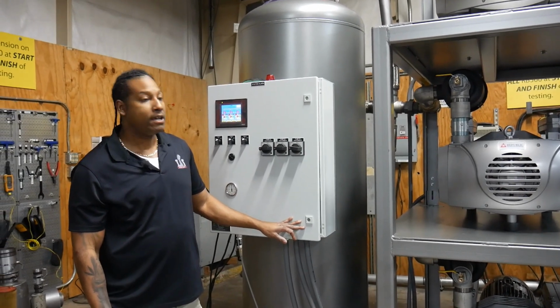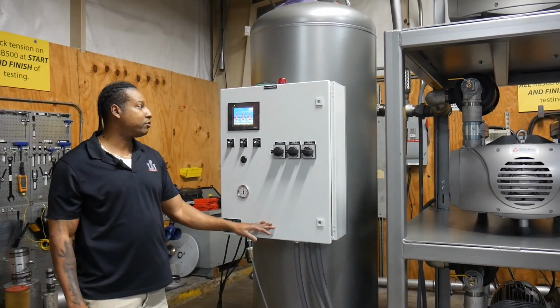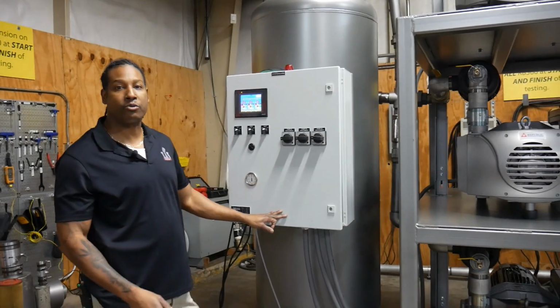Okay, now this is going into our QC process. We just finished manufacturing this? Yes, we just finished manufacturing it, and so we want to run it through all its paces and make sure all the alarms work that are supposed to.